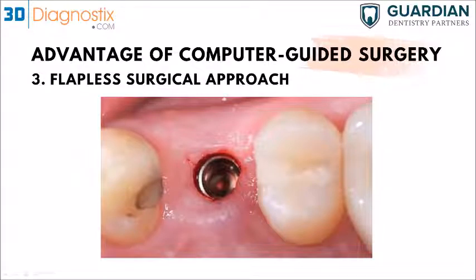Of course, we do. But I think what he's saying right here is sometimes we place the implants a bit deeper, and sometimes we would need to do some plasty or crestal bone profiling, and that could be difficult through a punch. Sometimes the site needs to be flattened. Exactly.